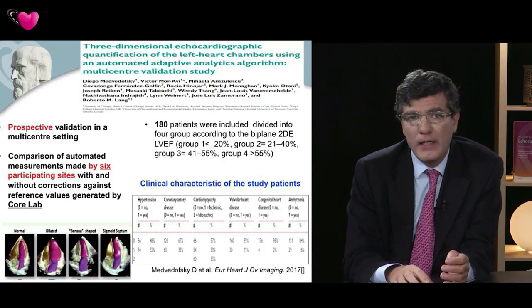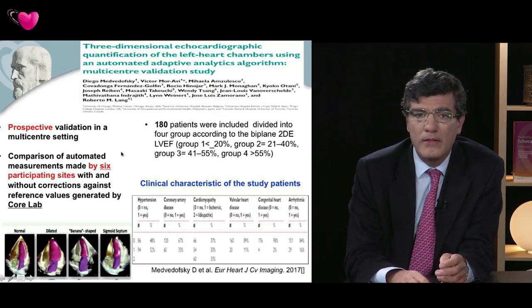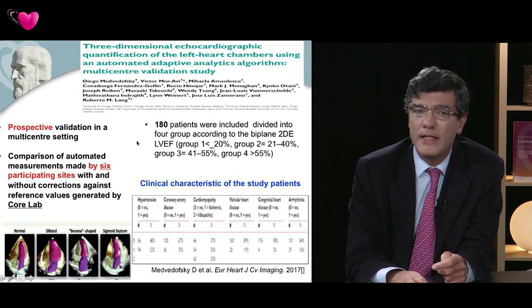We do have, and this is the paper that was published. We have participated in this study, 6 different centers, more than 150 patients. In fact, 180 patients were recruited for the study, and we divided these patients into 4 groups according to the ejection fraction, estimated by 2D echo.